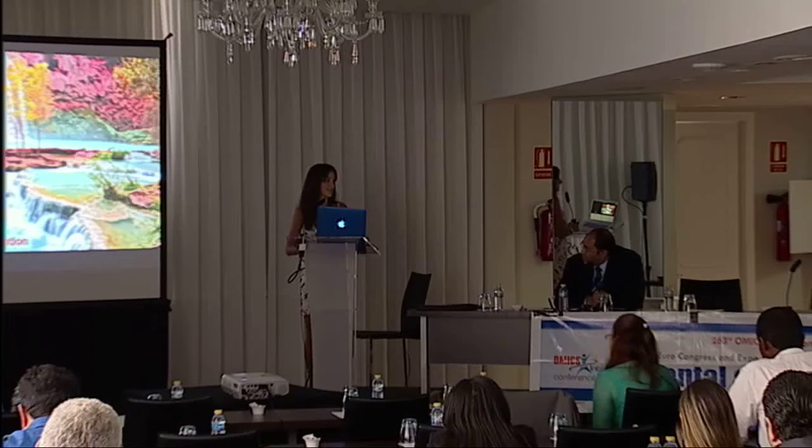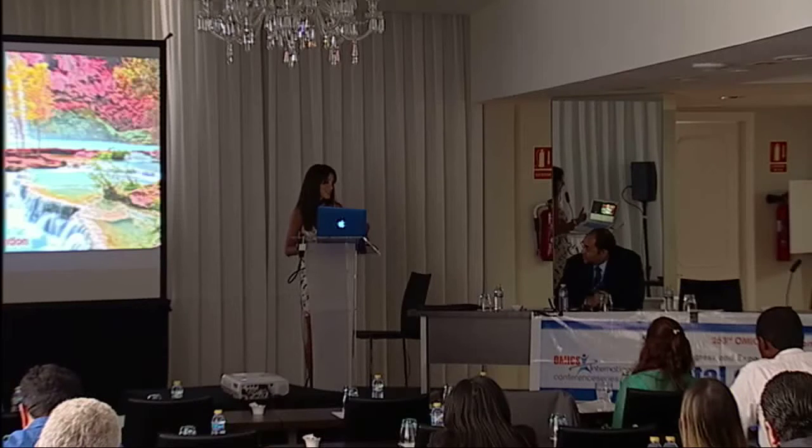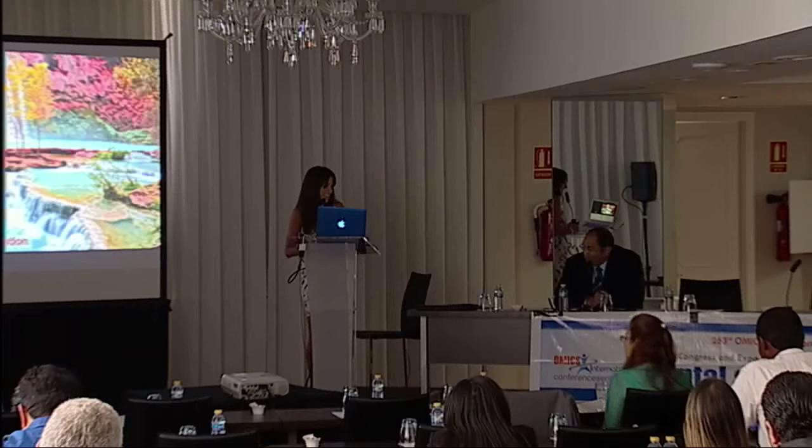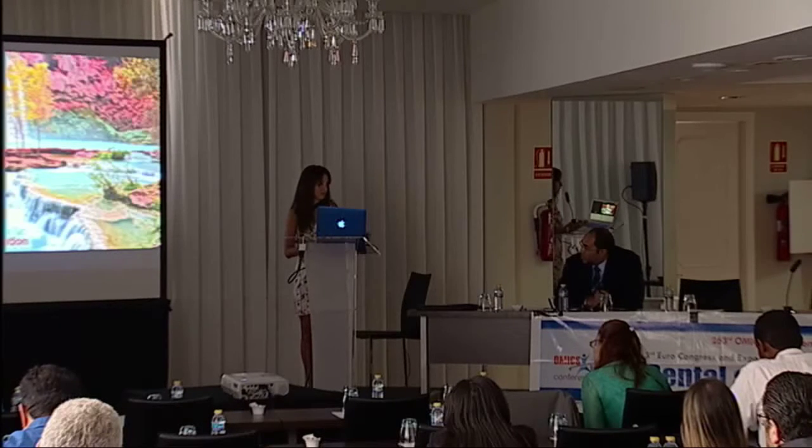No, because the soft tissue, when you see it on the CBCT, is not as precise as when you see it when doing also a facial scanning. Even with the new Planmeca machine that they have? Because I saw the results. They were pretty impressive. It's always better to use the facial scanning combined with the CBCT. There's no reason why you wouldn't.